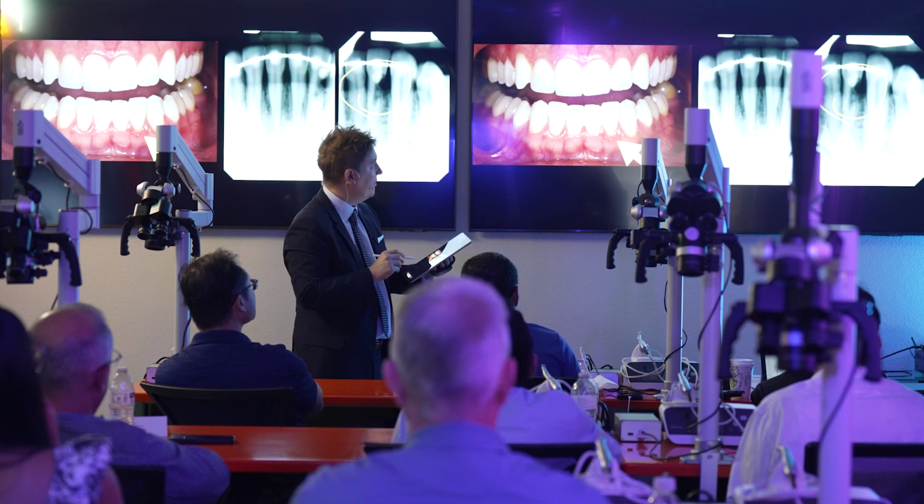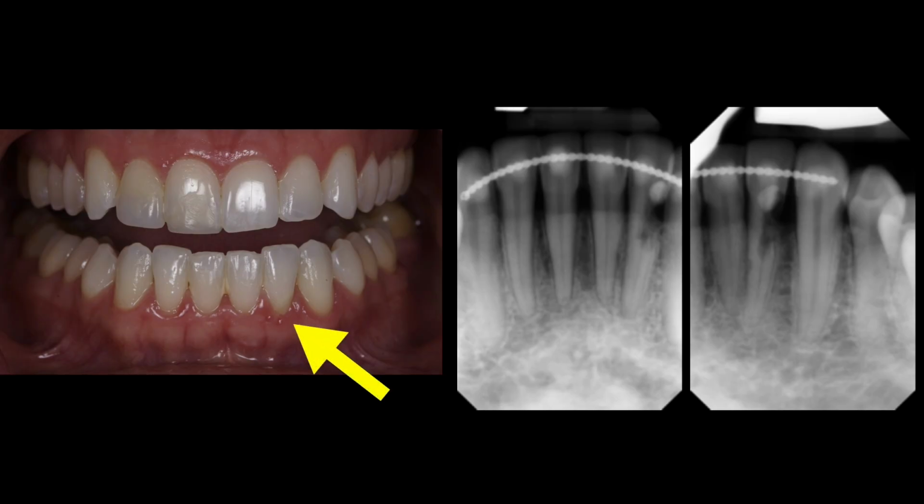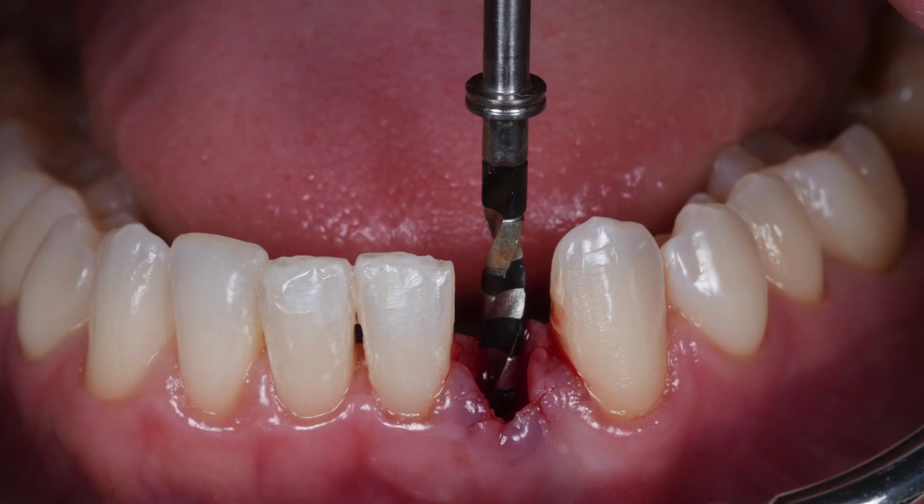She has a resorptive lesion on this lateral. How much bone do we remove? None. We don't even lay a flap. We never want to lay a flap when we're trying for preservation, which is what we want.